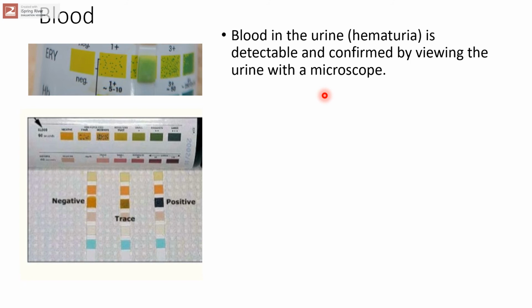Now, these crystals, when they pass through the urinary tract, the ureters, can cause damage, and they can cause some amount of bleeding. But obviously the presence of blood in the urine is not good. Now, this usually happens in extreme conditions when there's an internal damage to the nephron, right? Otherwise, the presence of blood in the urine is never a good thing.